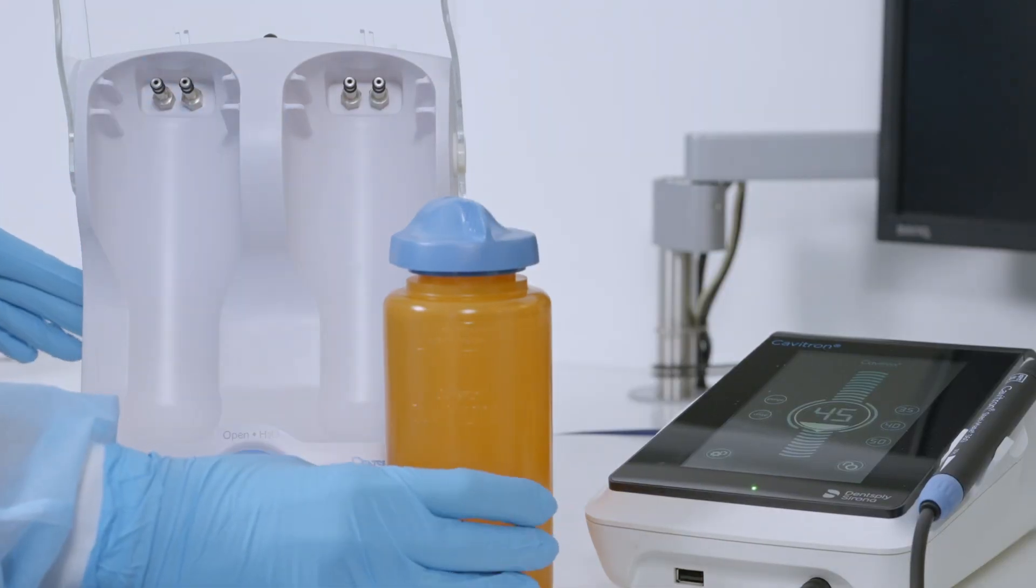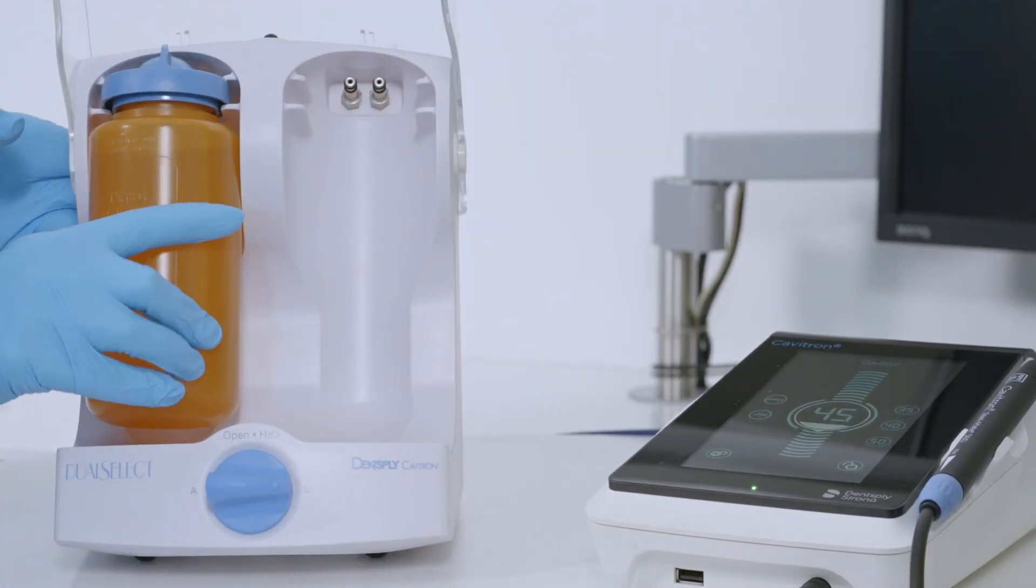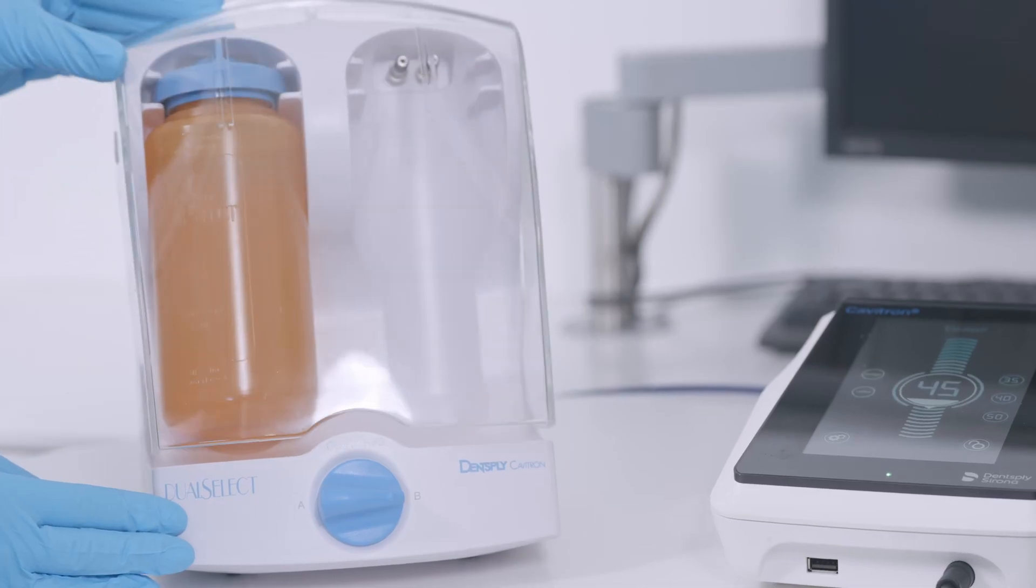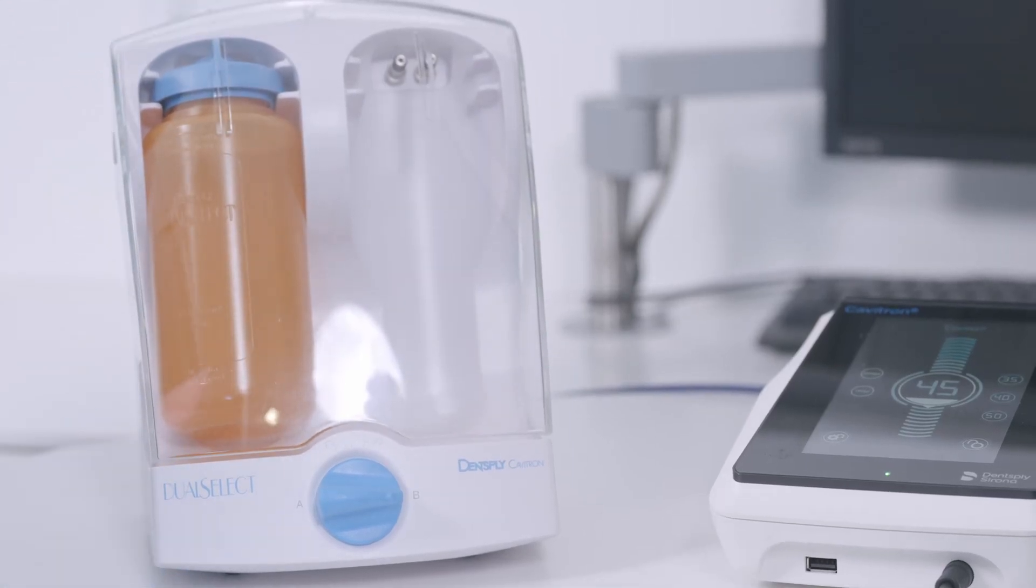Place the orange disinfectant bottle in position A, close the shield, and set the selector knob to position A.